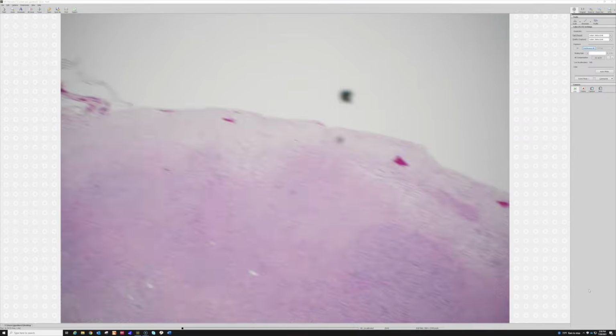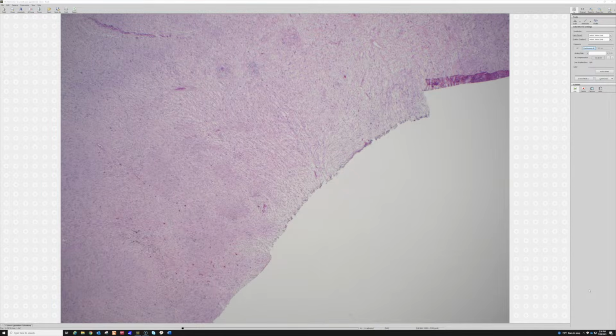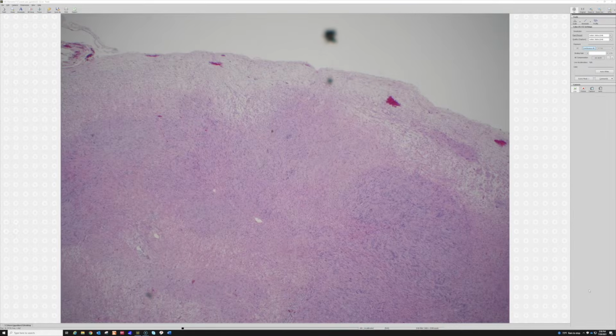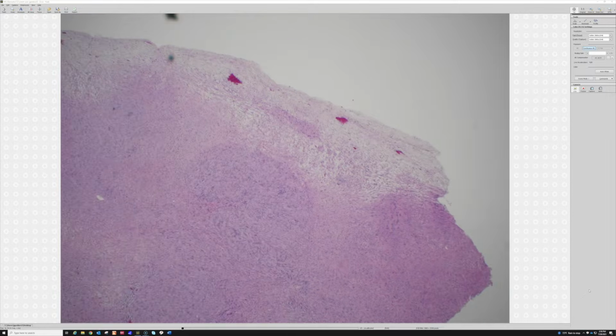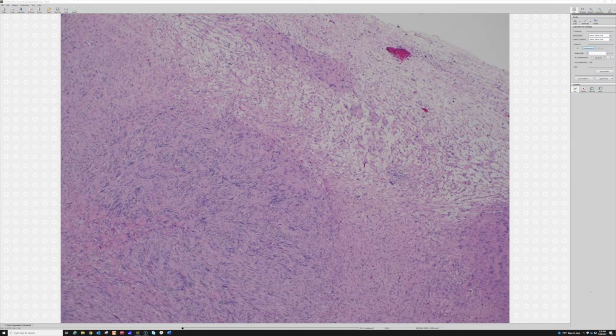Here we've got half of a nodule, it looks like, cut down the middle. This is the lowest power I can get. So what do you think from low power? Like what's going on here? From low power, I can see that there are some hypercellular and some hypocellular areas. Good, yes. And it seems to be formed from spindle cells. That's right. It is made of spindle cells.